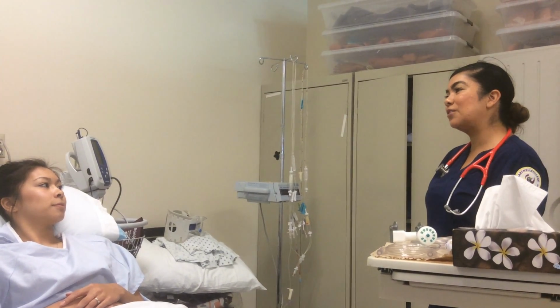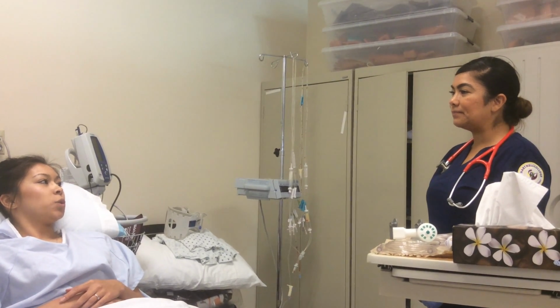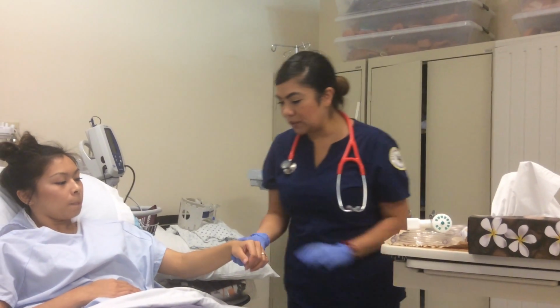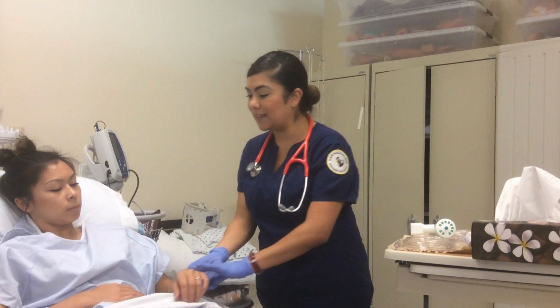Okay, first can I start off by asking you what your name and your date of birth is, please? Diana Ivy Cedeno, 9/21/92. Okay, perfect. May I check your wristband? Okay, thank you. So I'm just going to check her wristband to make sure that it correlates with what she said, and it does. Okay, thank you very much.